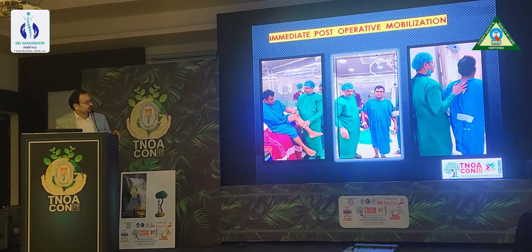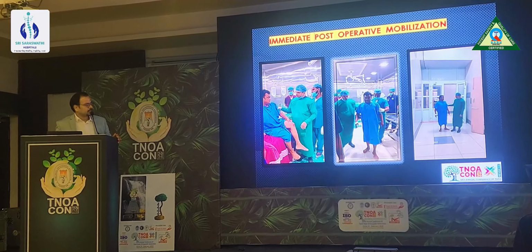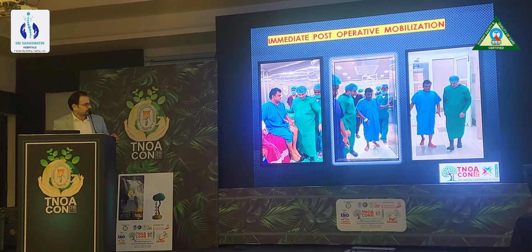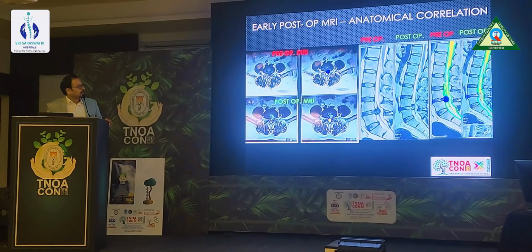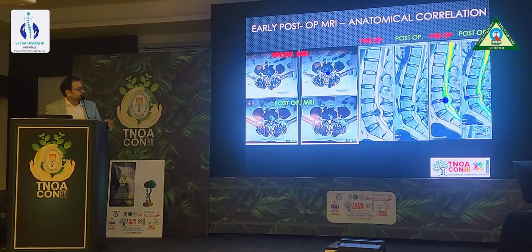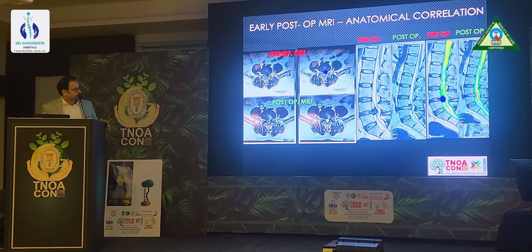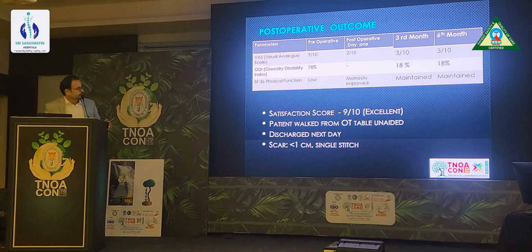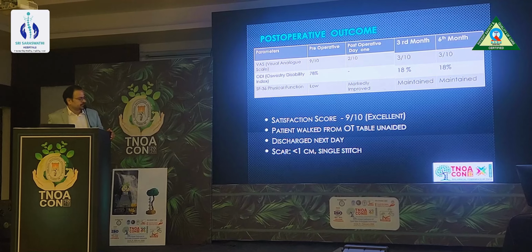The patient was mobilized from the theatre and asked to pass urine. His neurological safety was good. This is the post-operative MRI. You can see neural decompression is there with the posterior annular integrity. So his post-operative outcome was also very good, and the patient was discharged the next day.